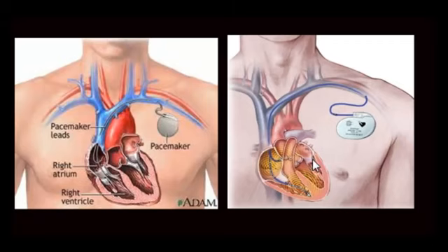The fourth condition in which we might put a pacemaker along with what is called a defibrillator, or the one that shocks the heart, if it goes into ventricular tachycardia or ventricular fibrillation, and that is known as the defibrillator. So the defibrillator not only has the ability to shock when a patient develops a fatal arrhythmia, but it also has the capability to pace the atria or the ventricle or both of them, depending upon the type of the device that is put in place.